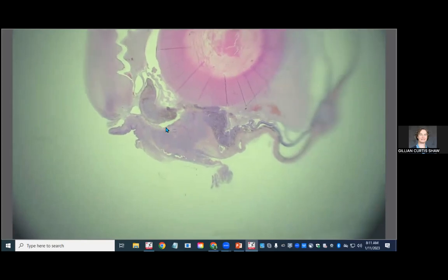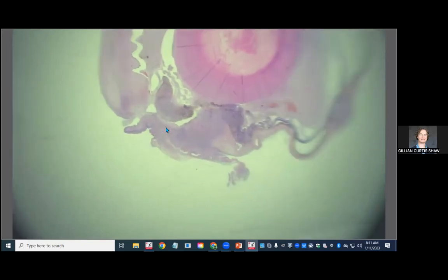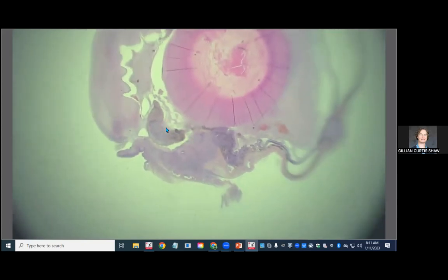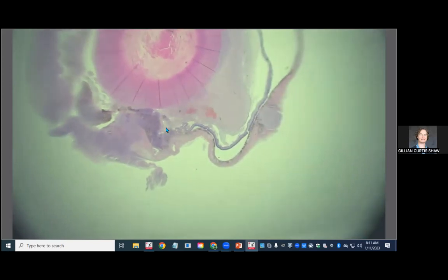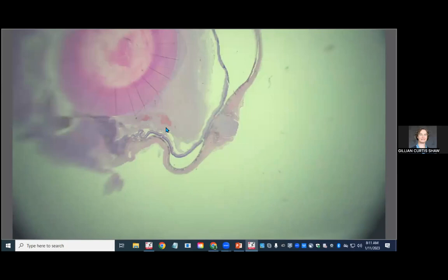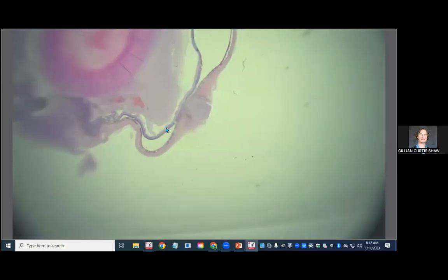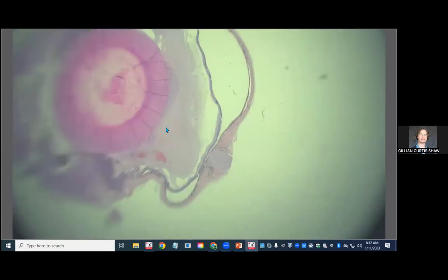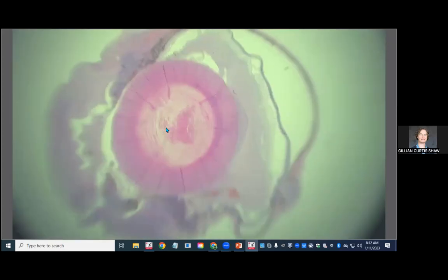And the big hole is bounded on either side by a lot of increased cellularity, which explains why it had a nodular appearance. This iris is also hypercellular and thick. And then going back into the ciliary body, there's also a lot of increased cellularity. And then as we track along the retina, it almost seems like maybe there's an extra layer, which we will go look at more closely. And then once again, there's a lot of cellularity in the vitreal space. And then right here in the middle, we have a really big lens.